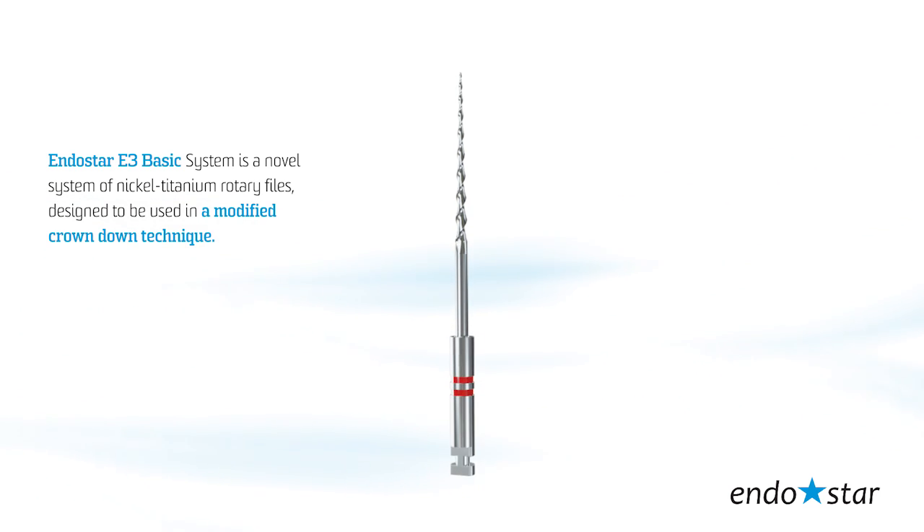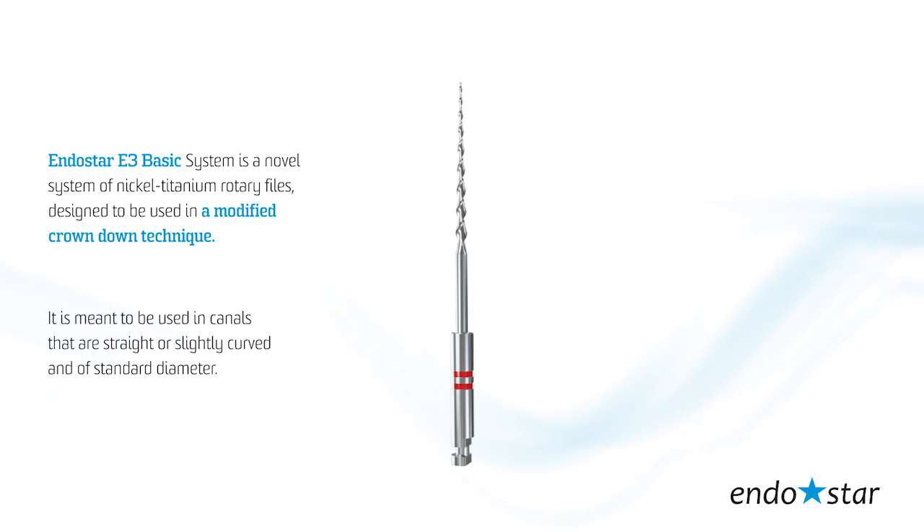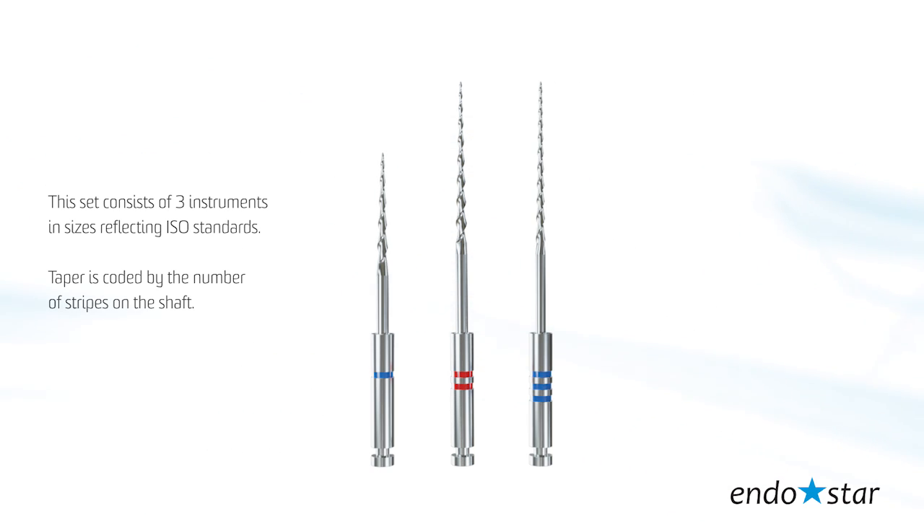The EndoStar E3 Basic Rotary System is an innovative system of nickel-titanium rotary files, designed to be used in a modified crown-down technique. It is meant to be used in canals that are straight or slightly curved and of standard diameter. This set consists of three instruments in sizes reflecting ISO standards.